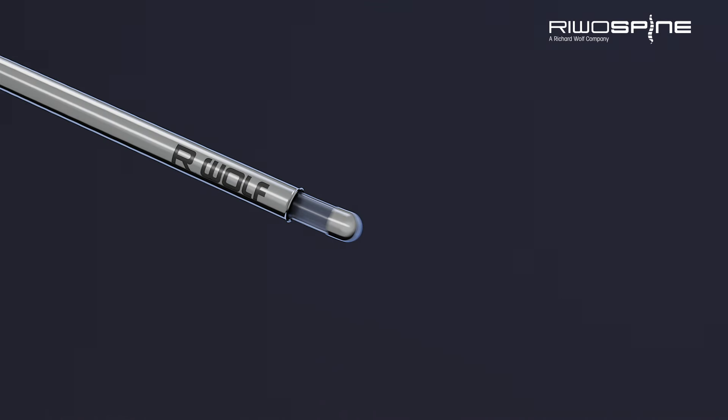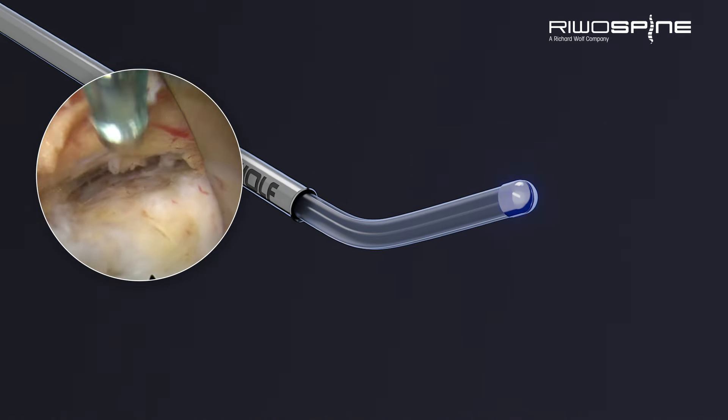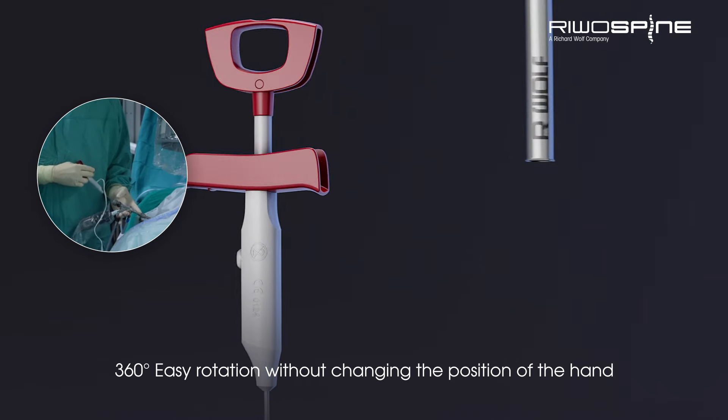With a unique handling, the tip control electrode stands alone in its field to make the surgeon's life more economical and comfortable. 360 degree easy rotation without changing the position of the hand.